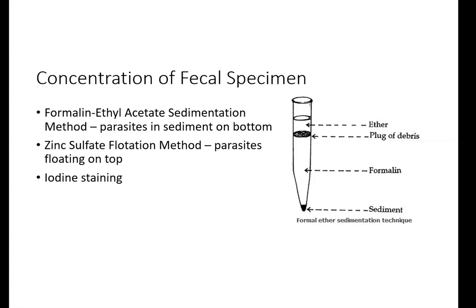With the zinc sulfate flotation method, instead, and I couldn't find a picture of that, all the parasites would be floating on the top. The problem with that is that any operculated eggs, which I'm going to talk to you about later, lots of times they'll open up or they'll just crush. So the integrity of what you're looking for isn't always maintained with the zinc sulfate flotation method.